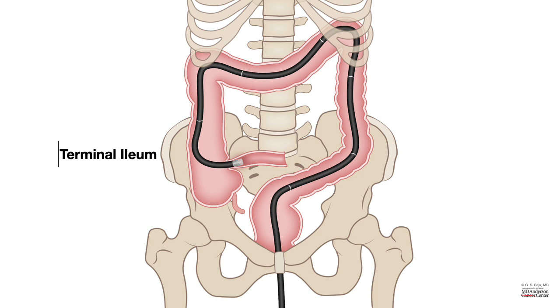Sometimes people can make a mistake when they have reached the hepatic flexure and assumed it to be the cecum. And I have seen where someone thought that they had reached the cecum when in fact the endoscope was near the splenic flexure. One way to be absolutely clear and certain is to take a photograph of the terminal ileum, and nobody would doubt your finding that you reached the cecum.